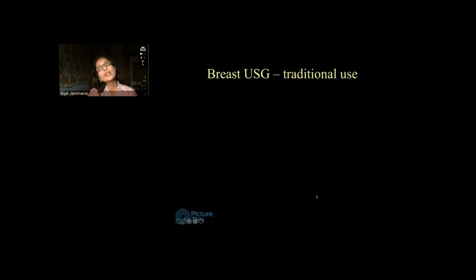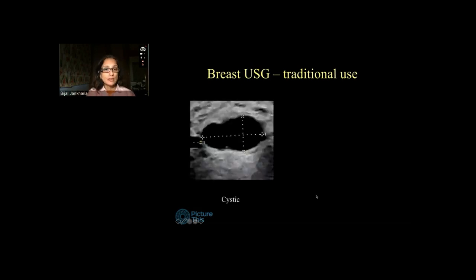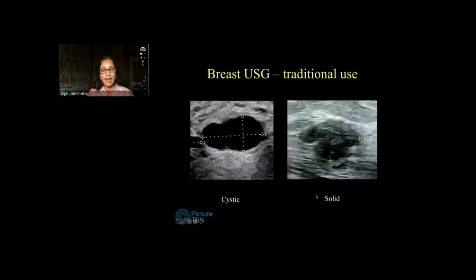So the traditional use, if you go back about 3 decades, the main use of breast ultrasound was to differentiate between cystic and solid masses. And that's all people used to do. Cyst hai ki nahi, ya solid mass hai ki nahi.